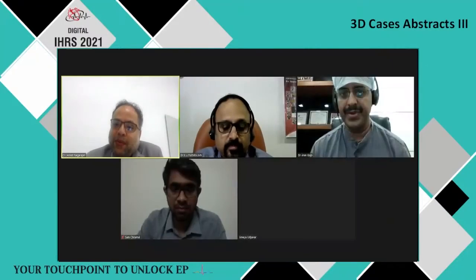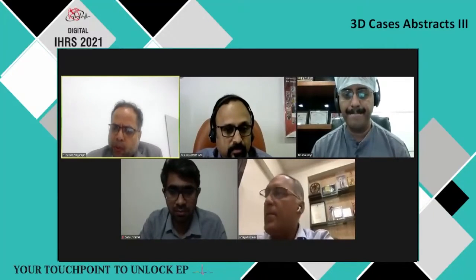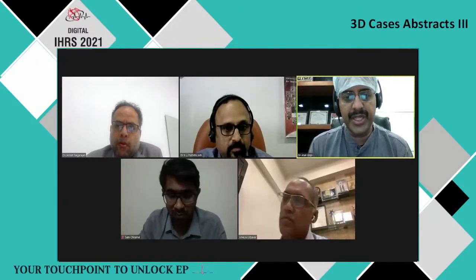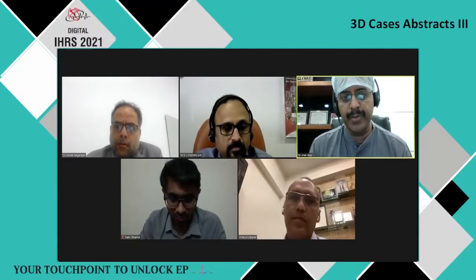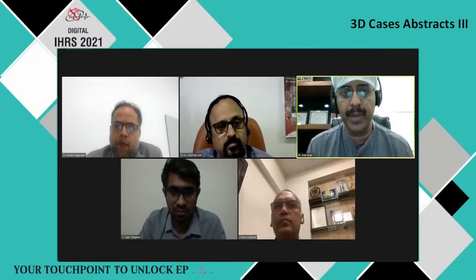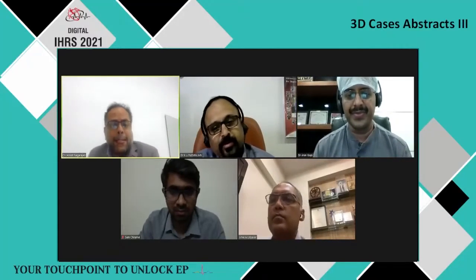Dr. Venkat, you want to ask Dr. Arun any questions? Yeah, it was a very impressive presentation of two very rare cases. But you said that you used an esophageal probe as well. Is that something that you routinely use for all the cases? Sir, for all left atrial ablations, we have an esophageal temperature probe kept in. Whenever we are ablating the posterior wall, we always pull in the esophageal electrode at the site of ablation and ensure that we stop ablation the moment temperature rises. For any posterior wall ablations, we have the esophageal temperature probe kept in. That's good. Thank you. I don't have any more to ask you.